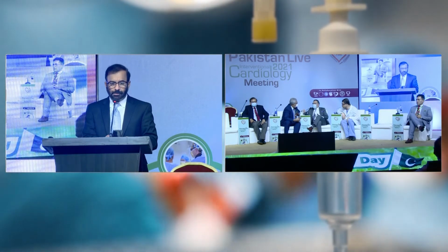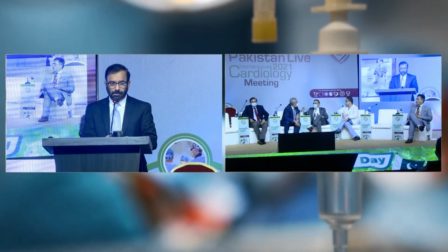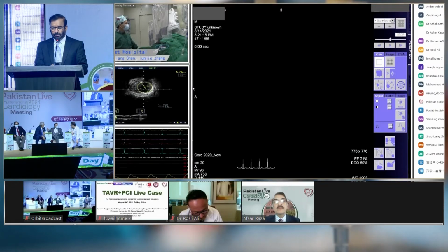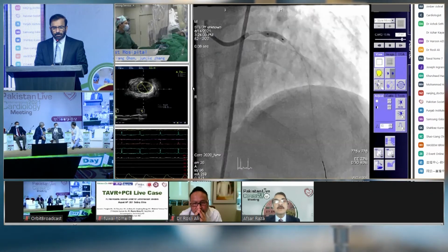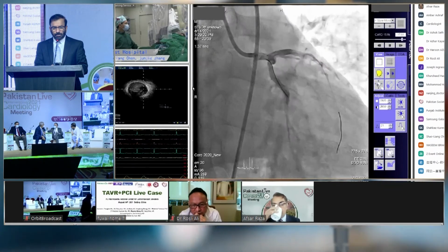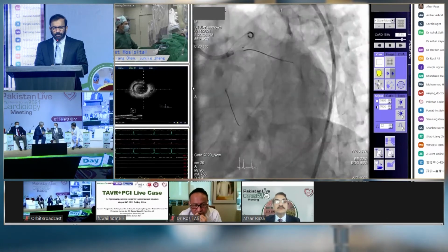And considering there is a huge aneurysm in the distal left main, and the aneurysm diameter is 7 millimeters, after POT with the 4.5 balloon, we do the final kissing. We rewire the circumflex, and with two 3.5 balloons in the LAD and the circumflex, we do the final kissing. Can you see the angiogram? Yeah, we can see.